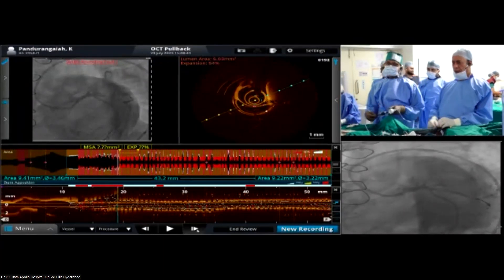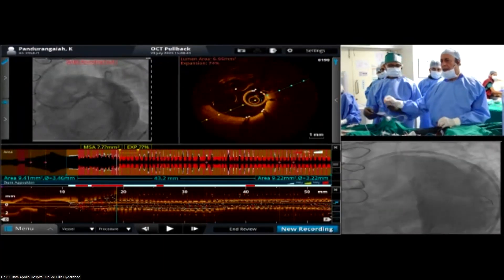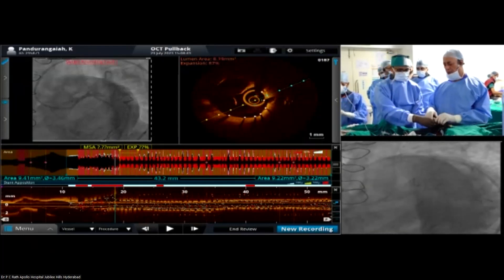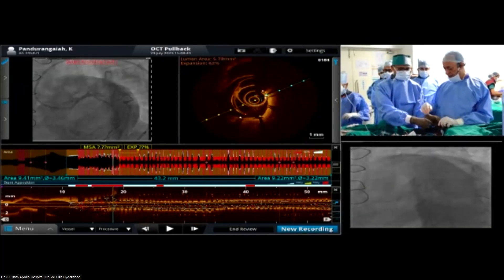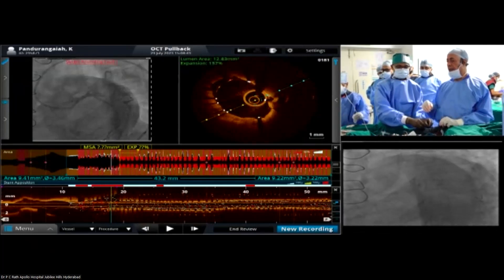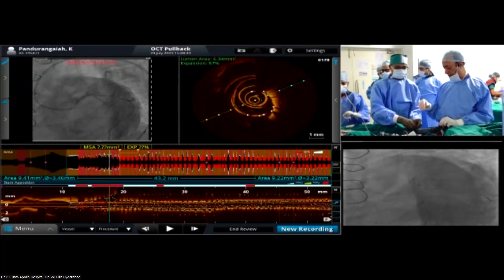The angiography looks very good. What we'll do is use the OCT again and see how it looks — same technique, using the telescope catheter.